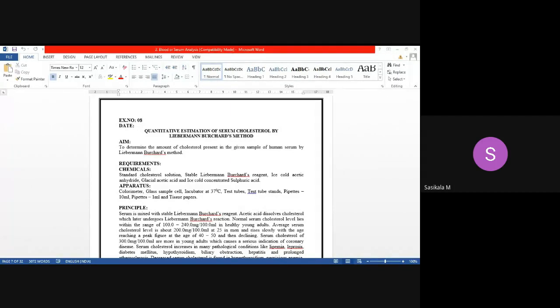What are the types of blood samples we'll be analyzing? Yeah, plasma, whole blood sample, and another one. What are the three samples that will be analyzed? Yeah, serum. Thank you, Harish. Subhikshna and Surya Prakash have also given the answer. Pramod, Akash, okay, very good. Serum, plasma, and whole blood will be analyzed.